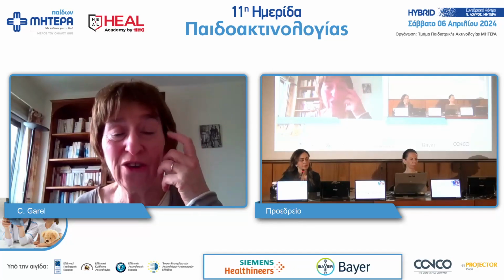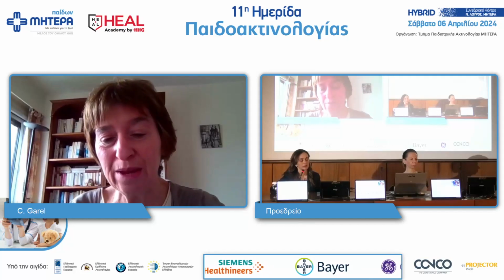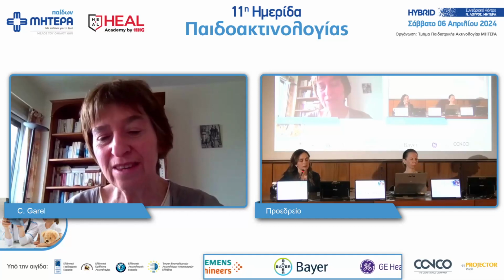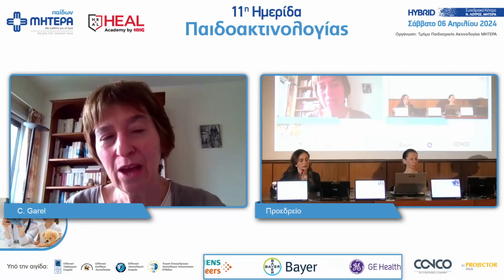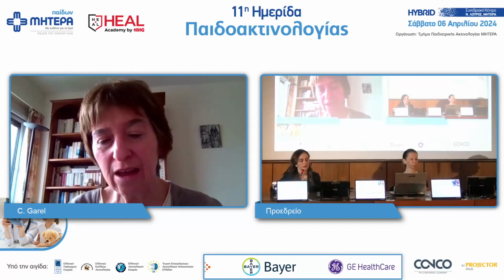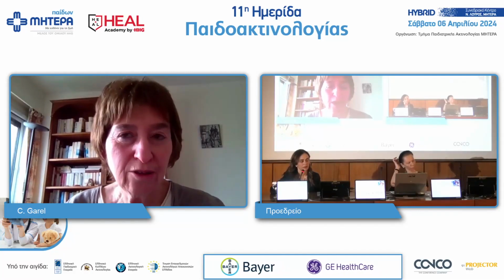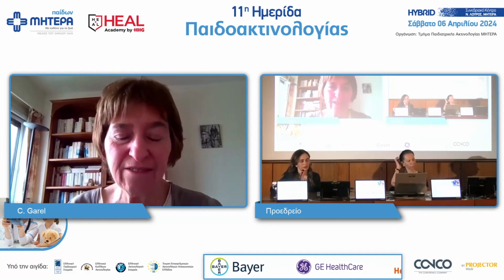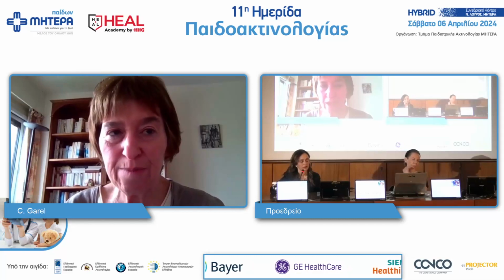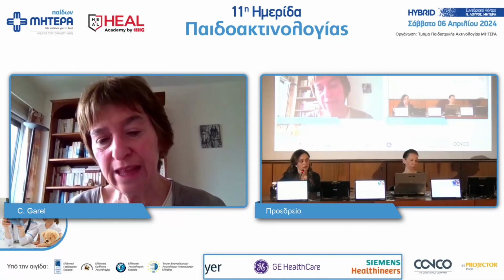No. Usually, it doesn't help us to follow up because we face the same questions. And we have to use both ultrasound and MRI. It is very important to be familiar with these entities also with ultrasound, because we see much better the details of the vermis with ultrasound than with MRI.